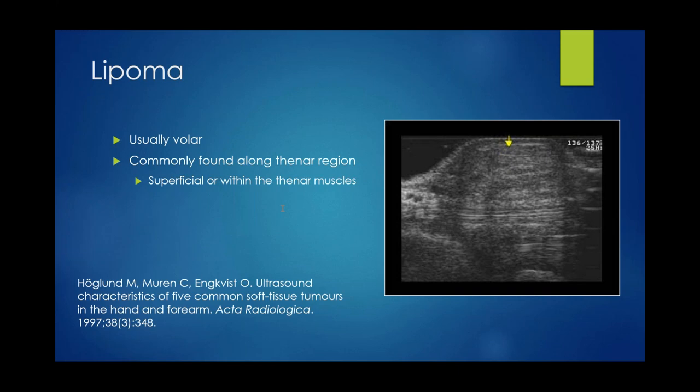The gauge of the needle depends on what I'm trying to achieve. If I'm just doing an injection of cortisone or something else, I would traditionally use a 27 gauge, inch and a quarter needle. If I'm going to aspirate, then of course I would anesthetize first, and then I would use an 18 gauge, inch and a half needle.